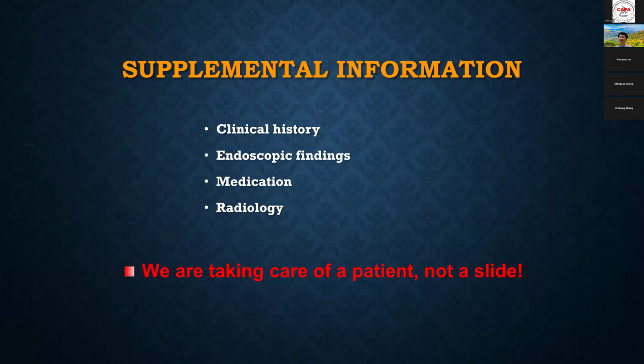So this is the last slide. So for chronic colitis, the pattern is not that difficult, right? And I think every first-year resident should be able to tell there's a chronic colitis, and if that's active or not active. But the underlying etiology is important because that will guide clinical management. So we have to do our additional work to make sure the etiology gets explored, right?